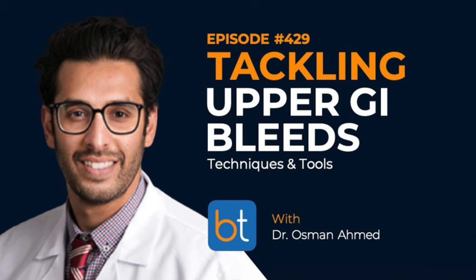100%. I should probably have clarified why I use a C2 if we're going after the GDA or something more distal, because of that exact same reason. When you have a reverse curve catheter, your catheter is just barely hanging in the celiac, whereas with the C2, like you mentioned, you can get a little more purchase and stability. That will also help you downstream once you put the microcatheter in, because it makes it easier to select smaller vessels when you have more support with your base catheter.